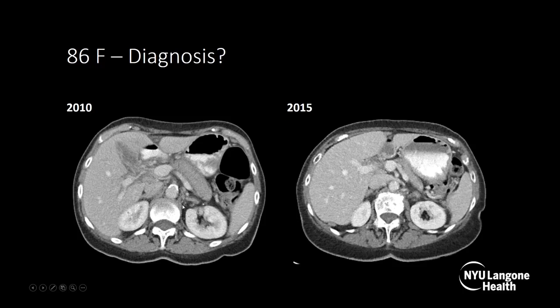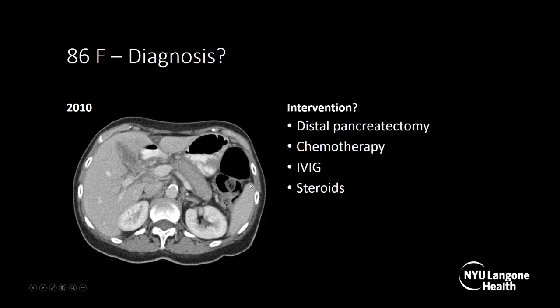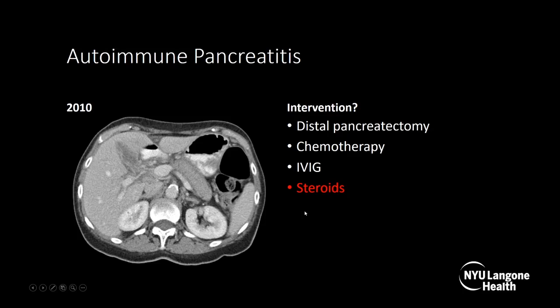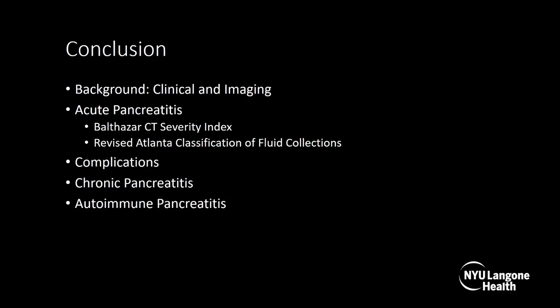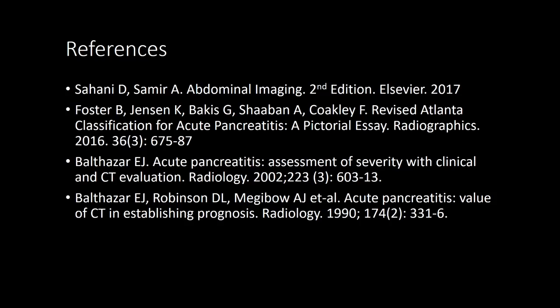This is an 86-year-old female with CTs from 2010 and 2015. In 2010, the pancreas is enlarged with a halo around it. In 2015, the pancreas is normal-sized without the halo. In this case of autoimmune pancreatitis, the patient received steroids, and that's the reason for the improvement. To conclude, we talked about background information, imaging findings of acute pancreatitis — specifically the Balthasar CT severity index and revised Atlanta classification of fluid collections — complications, chronic pancreatitis, and autoimmune pancreatitis. Thank you.